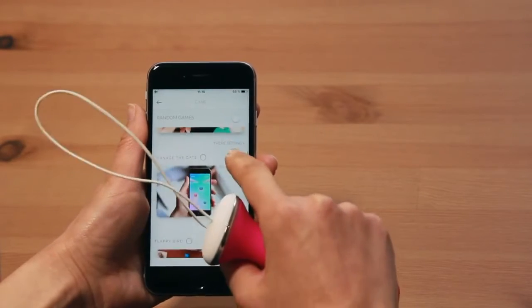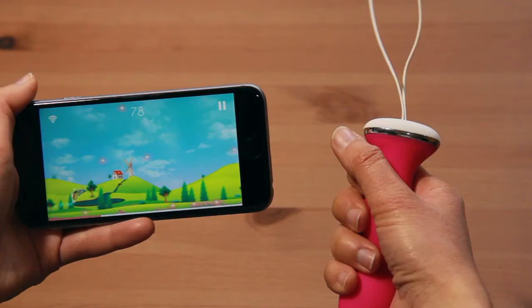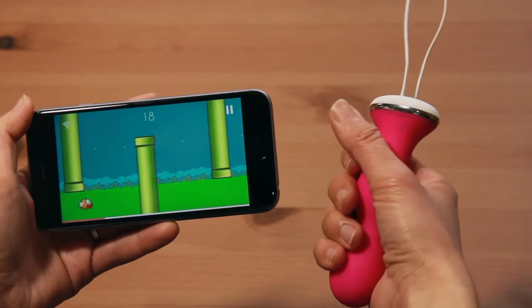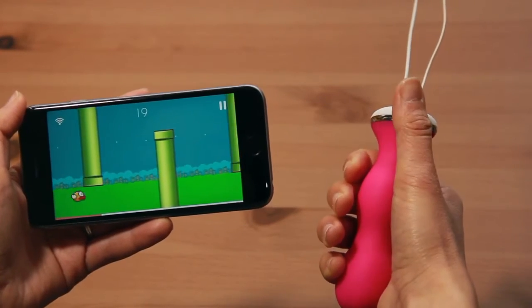You can also unlock other game designs, like the mountain, the pasture, or the countryside, or even popular games like Flappy Bird, so that your training never gets boring.